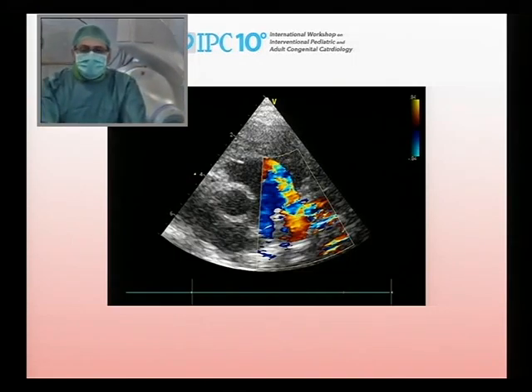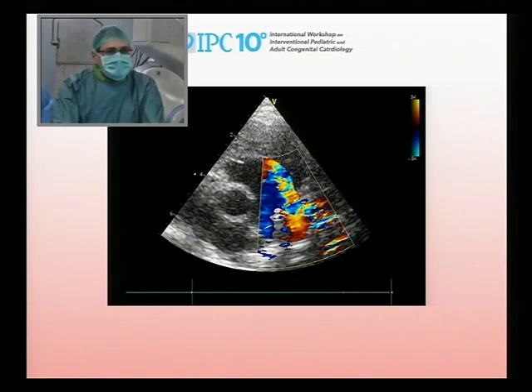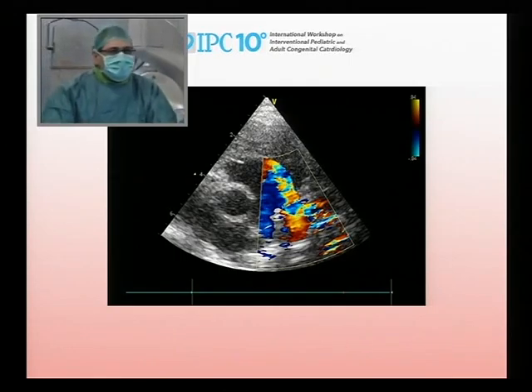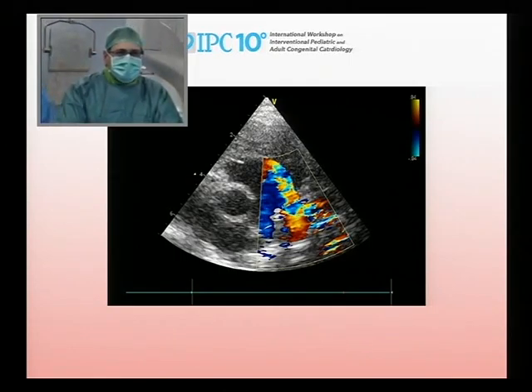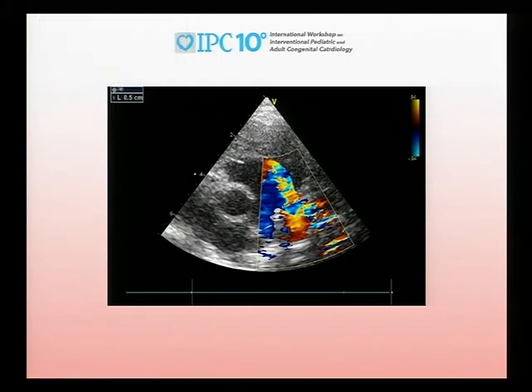The intended treatment is using an ADO 2 AS if it's possible. At cardiac catheterization, pulmonary artery pressure was quite high, with a mean pulmonary artery pressure of 28.